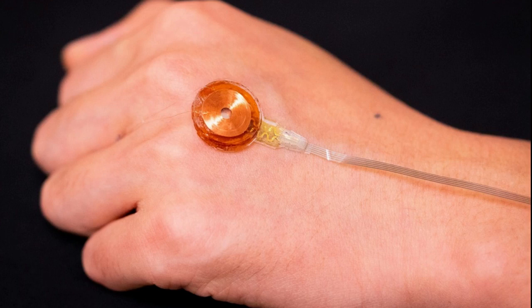After applying an alternating current through the copper coil, the magnet vibrates and creates pressure onto the bottom surface of the sensor. This would direct deformations that extend to millimeter scale depths of tissue, which leads to periodic variations in electrical resistance. Analysis of these responses by simultaneously measuring the voltage allows quantitative determination of the stiffness of the tissues. Each measurement could be done within 1 minute.